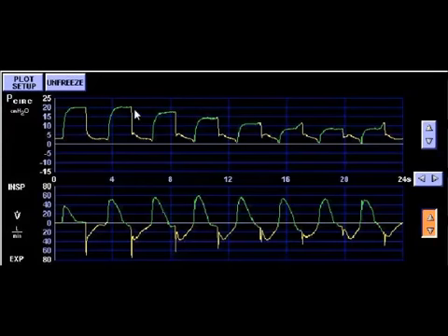So these decreases in peak inspiratory pressure are also going to decrease my mean airway pressures. So I'll run into issues with oxygenation also. That's why I highly recommend not using adaptive pressure control mode in a patient with a vigorous drive whose metabolic demand has increased significantly, or who is on high amounts of PEEP due to oxygenation problems.